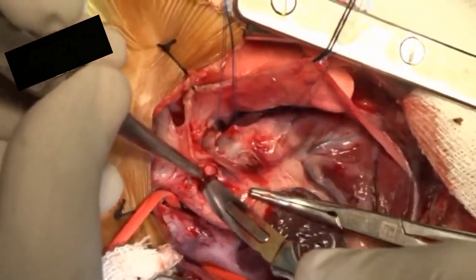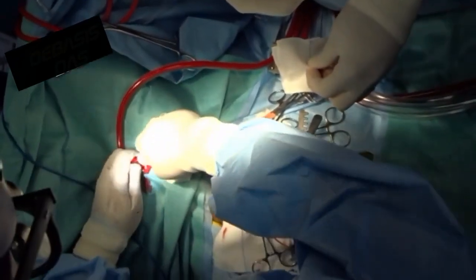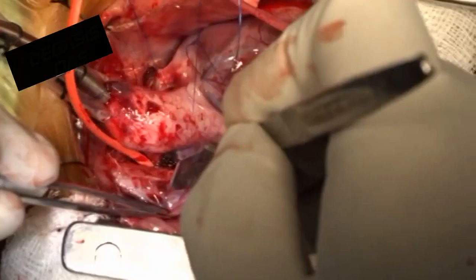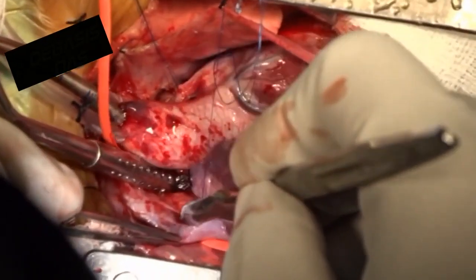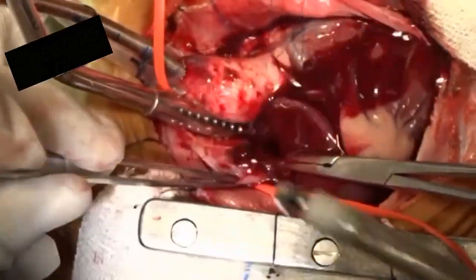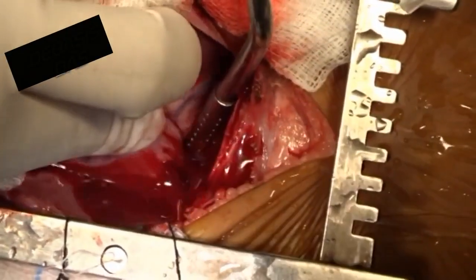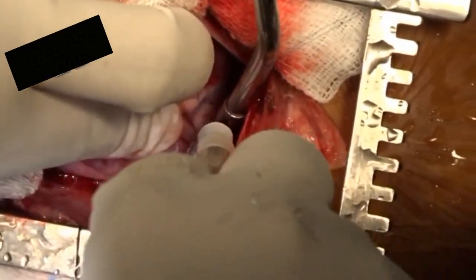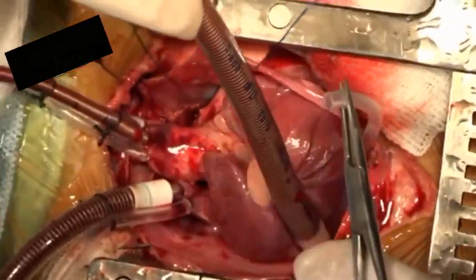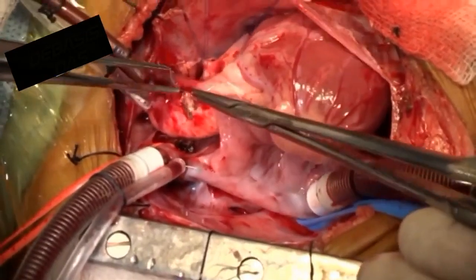The aorta is cannulated and then the superior vena cava is cannulated with an angled venous cannula. Cardiopulmonary bypass is instituted and the IVC cannula is then put. The patient is now on total cardiopulmonary bypass.